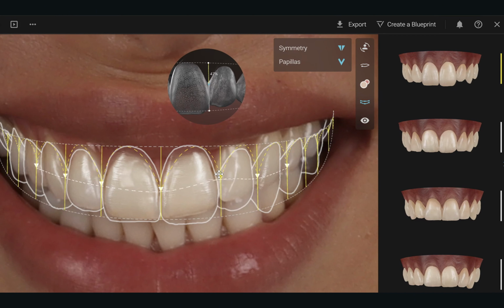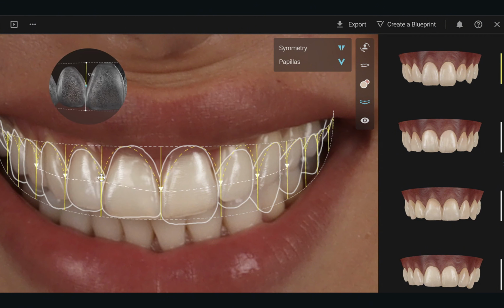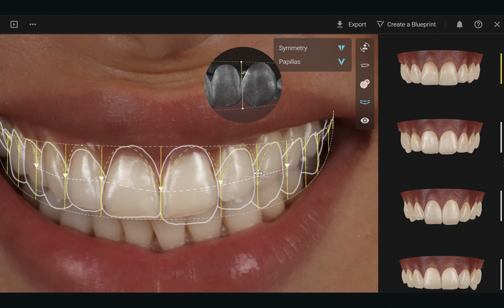So for example, as you're adjusting things, you can do it either unilaterally or bilaterally in a symmetrical fashion. The world is your oyster, really. There are multiple different shortcuts on the keyboard that you're able to use to manipulate and adjust. And you can see in real time things are changing, things are adjusting.